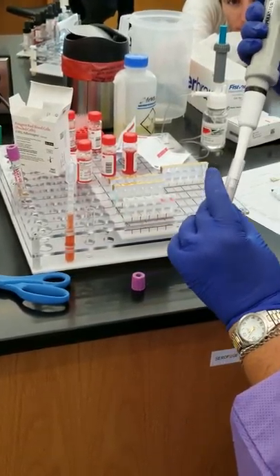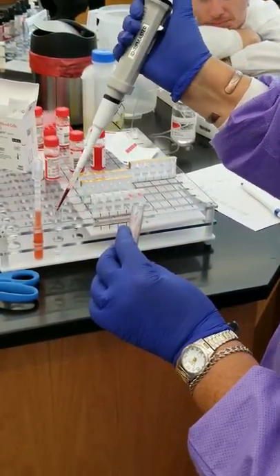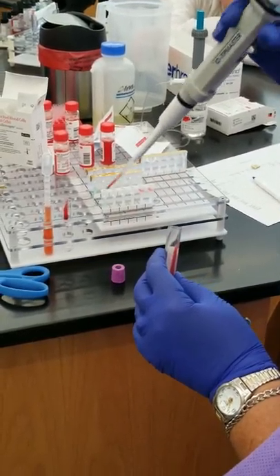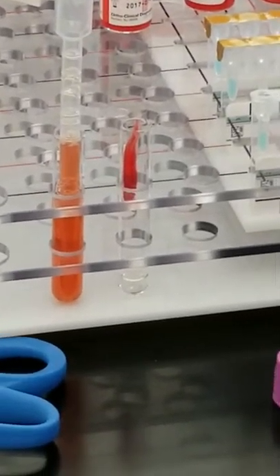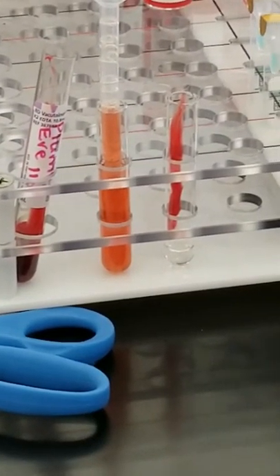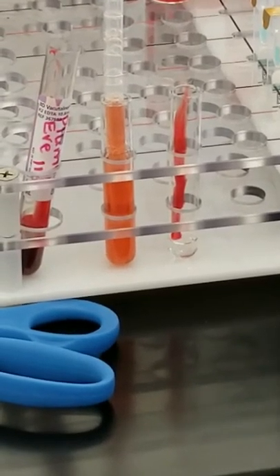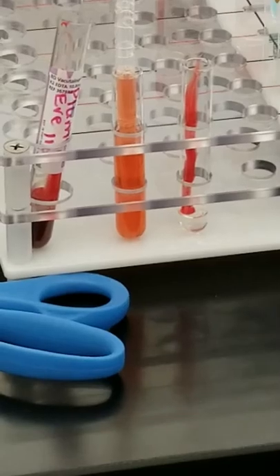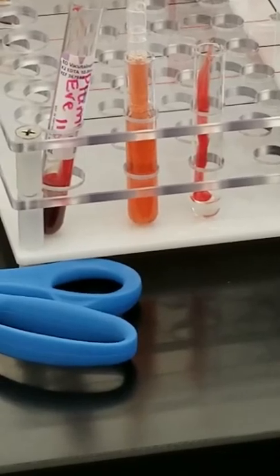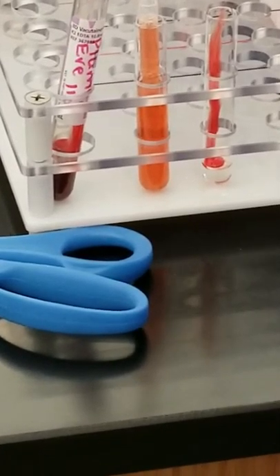I'm going to take 25 microliters of my packed cells, and I'm going to put that in with my 0.5 mLs of my diluent. I usually put it going down the side, and that's a Myra thing. The reason I do that down the side is sometimes you get more cells than plasma when you go down into the sediment. Other times you get more plasma than you really wanted, but this way you can kind of play with it and adjust your concentration a little bit.